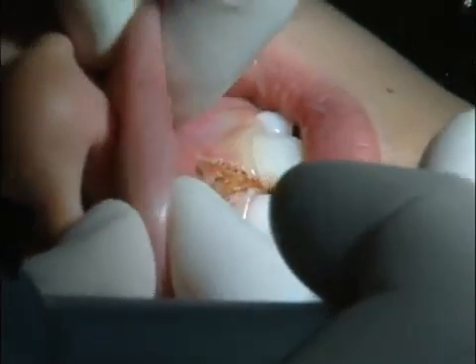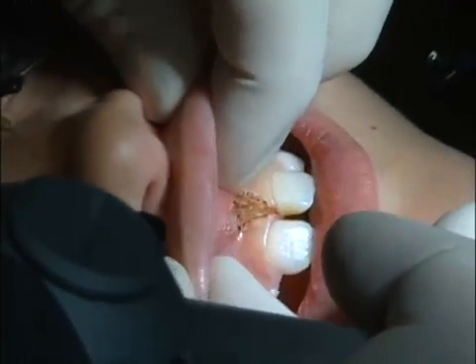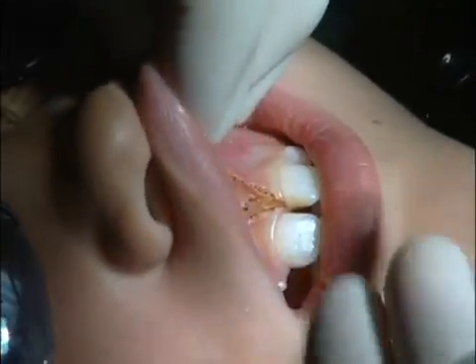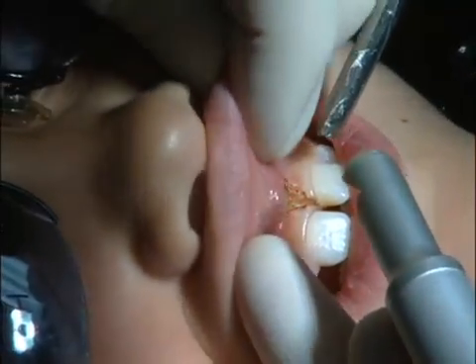Just put tension on the lip. If I felt like at this point I wasn't below the keratinized tissue, I would do a little bit more and just keep going laterally until I got it completely away from the keratinized tissue. So let's just say I wanted to do a little bit more here — I'd come right there and take it just a touch more away.